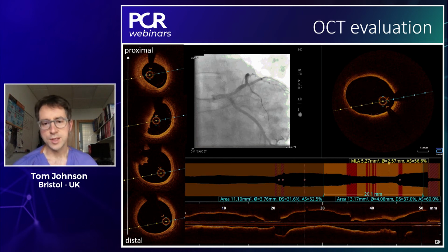So from this, I took that he has a highly thrombotic lesion. Has ongoing pain. I felt duty bound really to treat, and due to the ostial nature of the LAD disease, stent from left main to LAD using the appropriate sizing I've taken from the OCT. I mean, there could be an argument to just treat this guy aggressively with antithrombotic treatment and then see how this resolves as per the erosion study. But I think the unique nature of this being ostial LAD and the territory that's subtended made me feel much more comfortable with treating this up front with a percutaneous strategy.